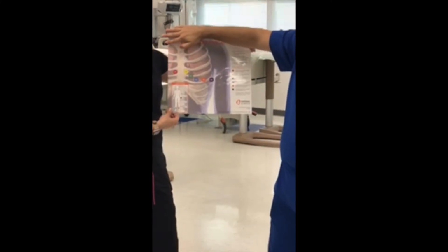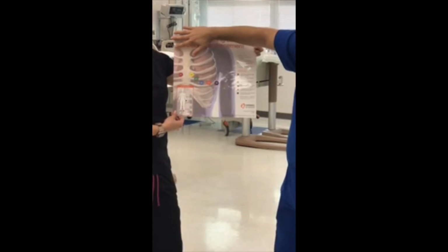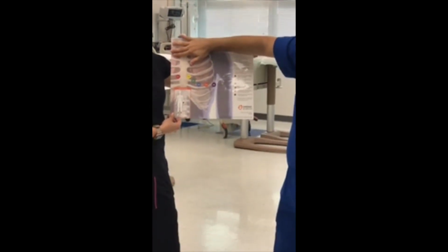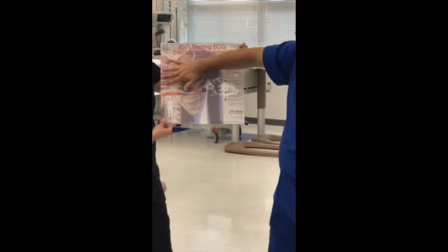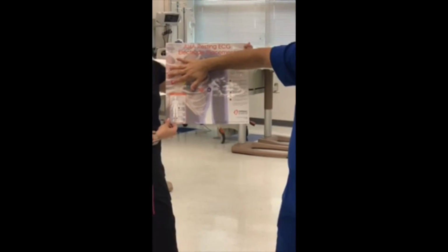Understand that the intercostal space directly below the rib is what correlates them together. So first rib up here, go down to the first intercostal space, the second rib, second intercostal space, third rib, third intercostal space, fourth rib. Right inside of this intercostal space is where V1 is going to lie.